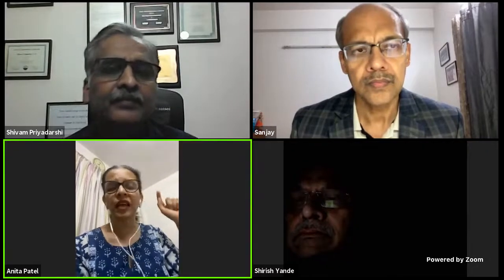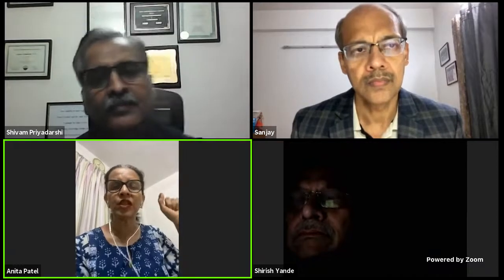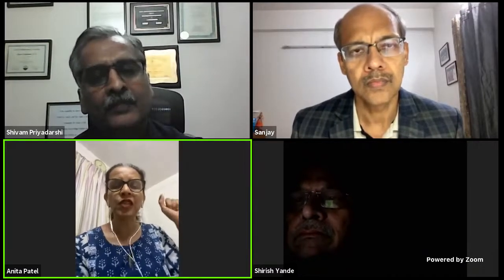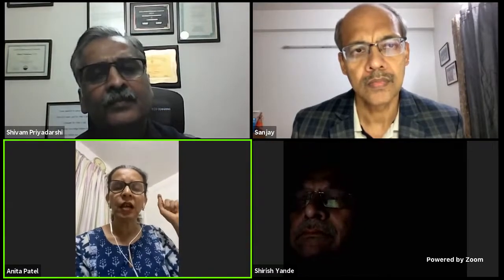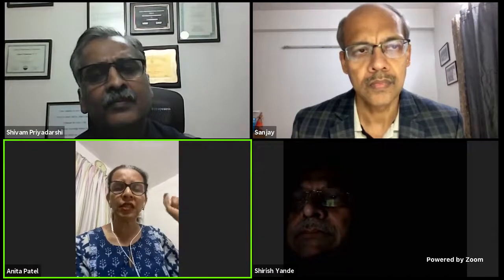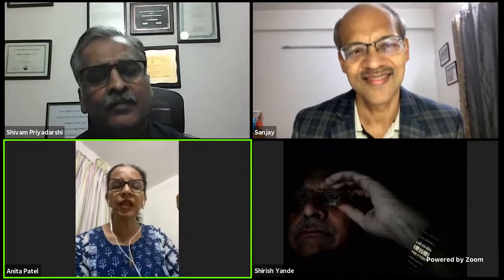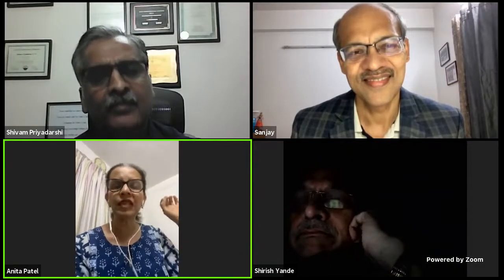Now, this is where in pediatric practice, this may be the only situation where I may want a little sedation. And I'm sure both Sanjay and Shirish would agree to that, because to have a child who's exceptionally cooperative, not moving, so that we get excellent images during a urodynamic can be a little tricky.